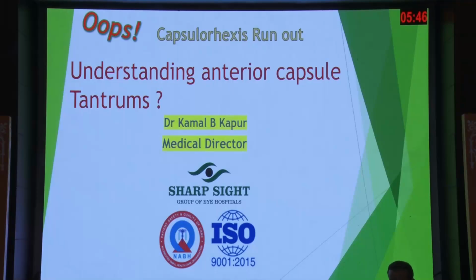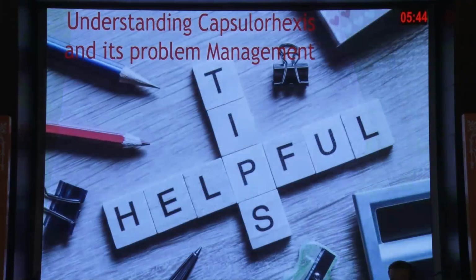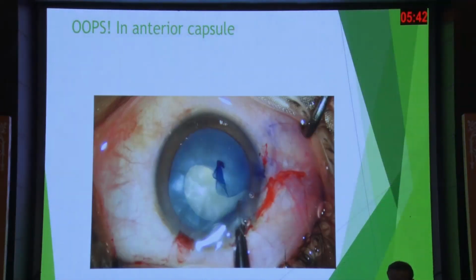Rexes hai to ho hi jayega. But what happens when rexes goes wrong? So let's see some helpful tips.